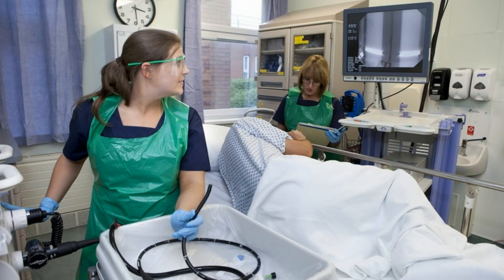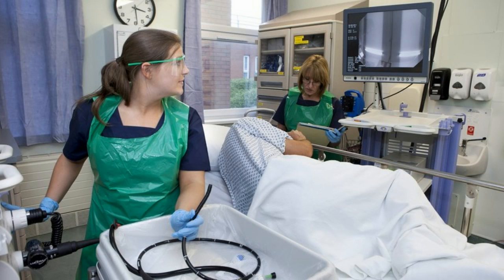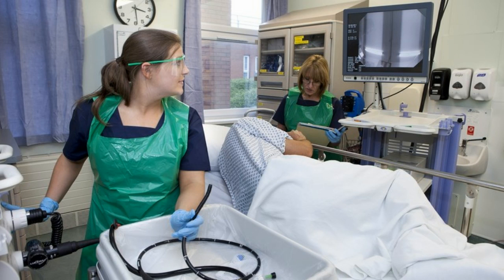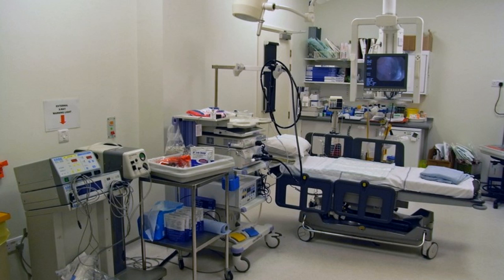The difference between endoscopy and gastroscopy. One of the most important tools in the modern clinician's arsenal is the imaging device. There are many imaging devices using a multitude of techniques, but the use of the devices which use normal vision to view structures is the most important.